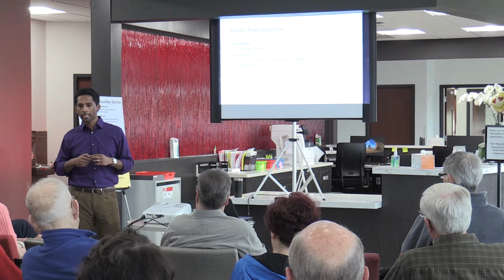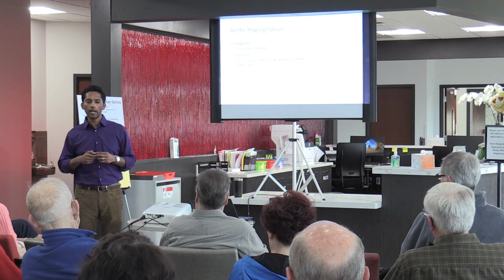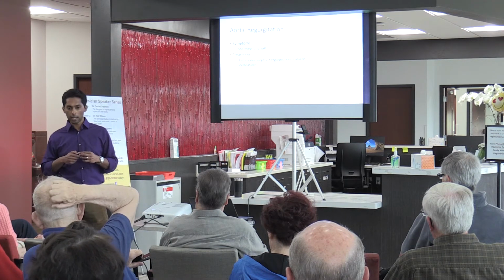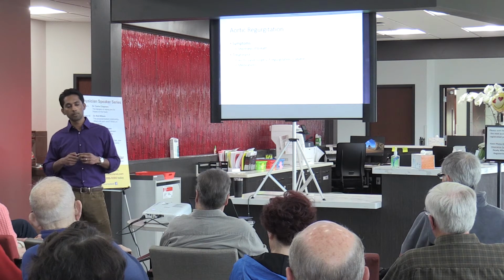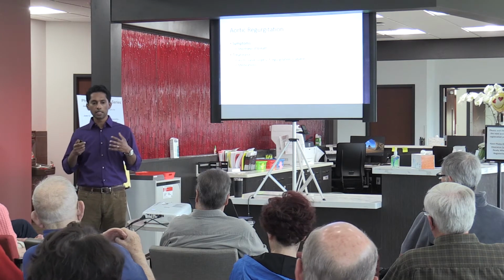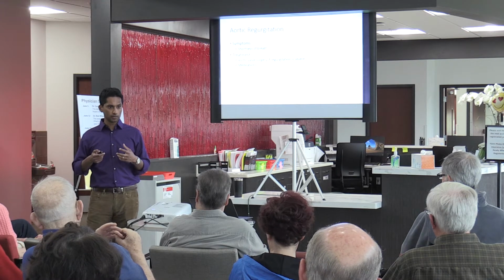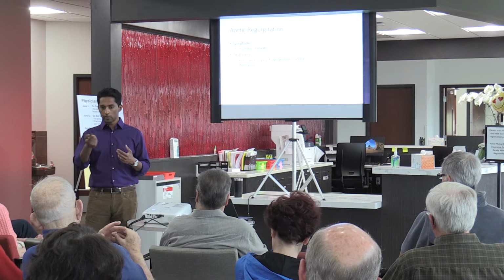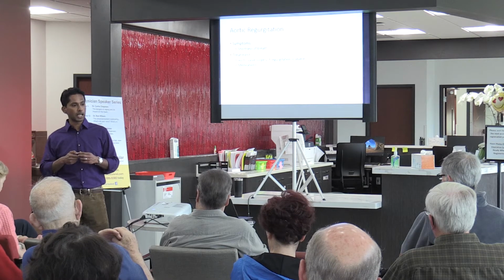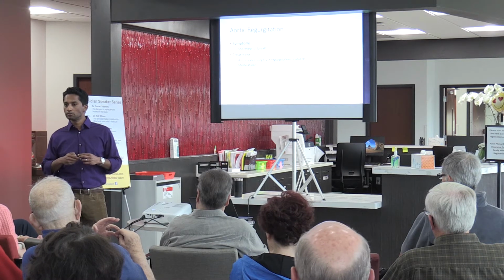Do both require anticoagulation? No. It's a good question. The question was, do they both require anticoagulation, or being on blood thinners? It's typically only mechanical valves that require being on blood thinners. If you have a bioprosthetic valve, with animal tissue in it, then typically those people don't need to be on blood thinners. The trade-off is that mechanical valves, which are all metal, tend to be more durable, right? So if we had somebody really young that needed a valve replacement, a lot of times they'll get a mechanical valve because you need that valve to last them a long, long time. The downside, obviously, is that you need to be on blood thinners. Conversely, if you had somebody that wasn't that young and wasn't such a great candidate to be on blood thinners, then maybe a bioprosthetic valve might be a better option for that person. Good question.